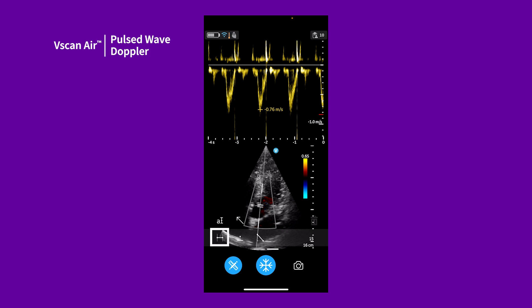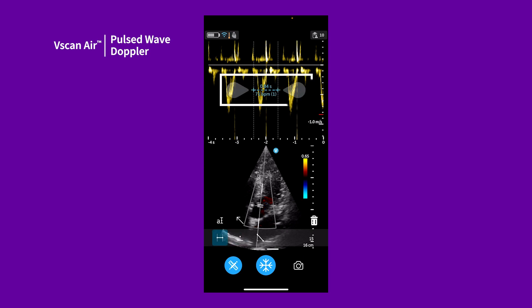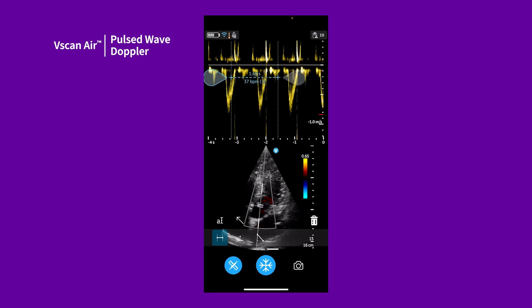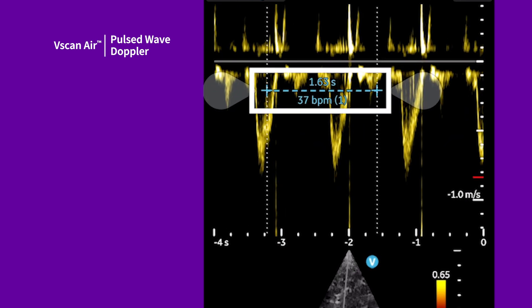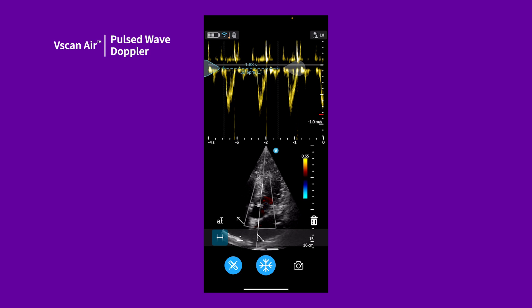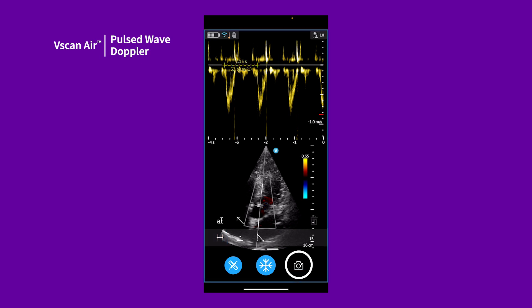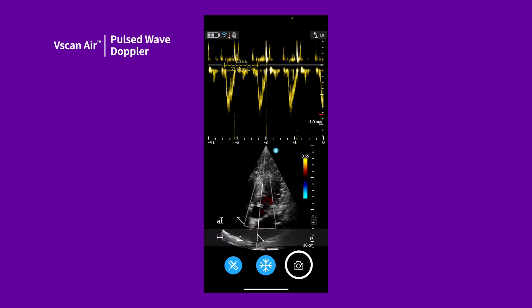Tap here for a time interval measurement. Position on the waveform for your desired time interval. The system displays the time measurement and the calculated heart rate. Note that the number of beats used for the heart rate calculation is displayed alongside the calculated heart rate.